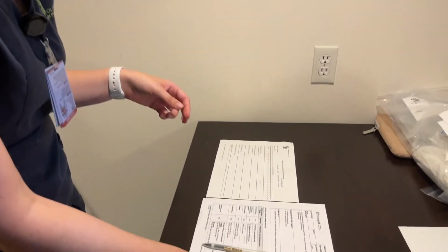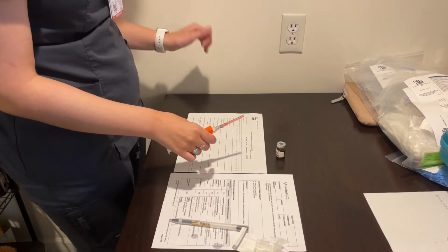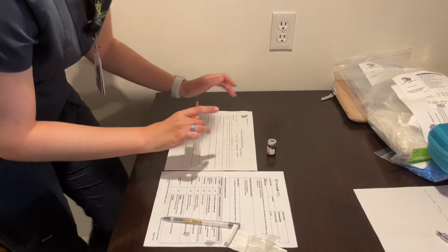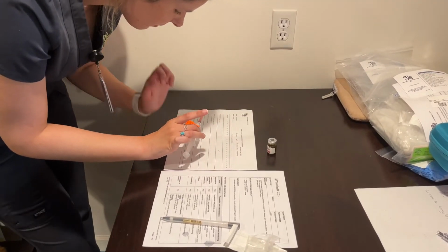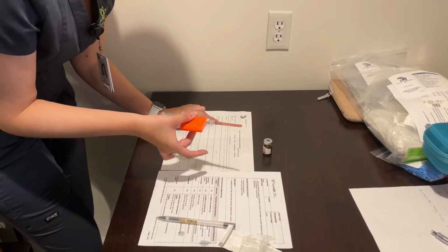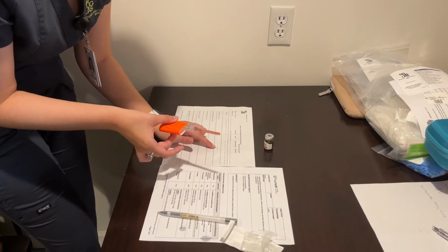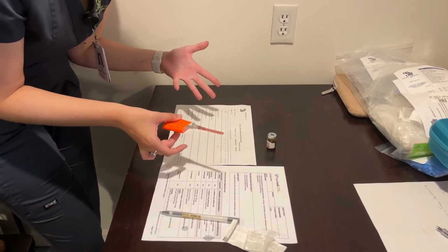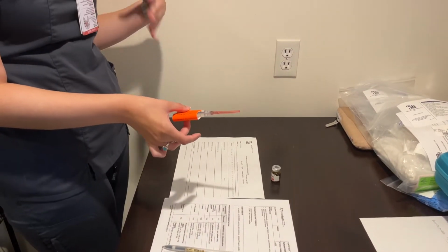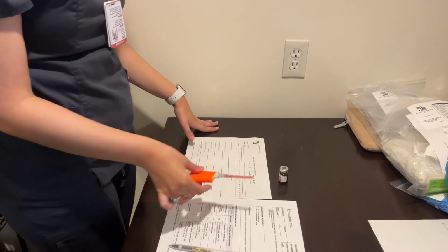So after that is done, I'm going to do my second check. So we have furosemide, yep, in here, furosemide, got it, 40 mg, it is IV. Right time is 4 o'clock. We're giving it for congestive heart failure. It's the right patient. And the frequency, we're just giving it once. That's all we know.